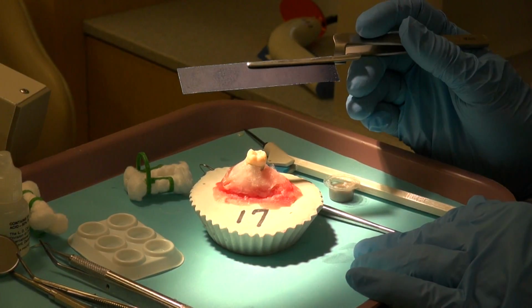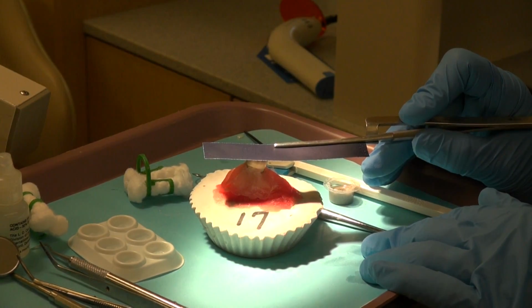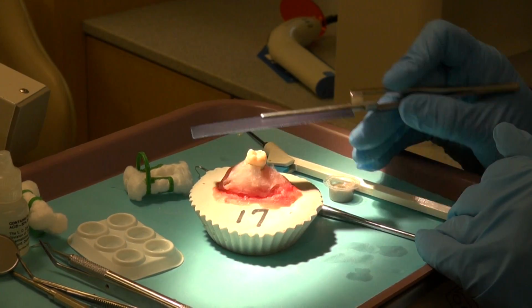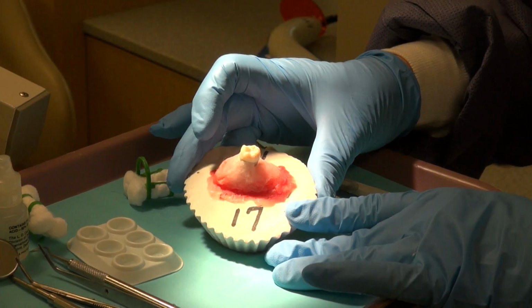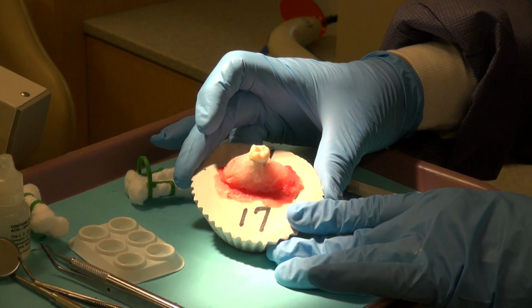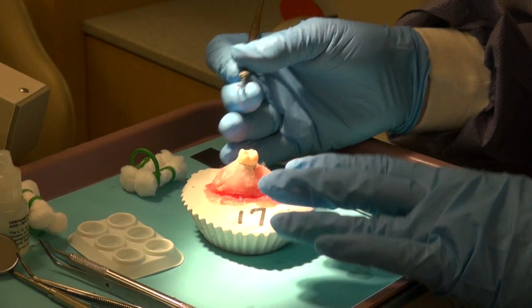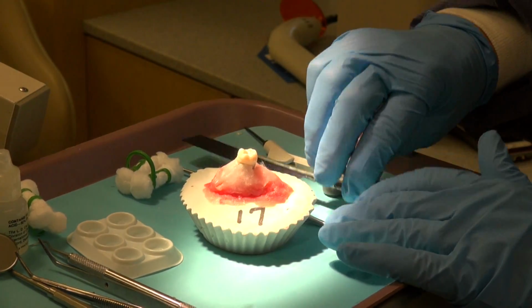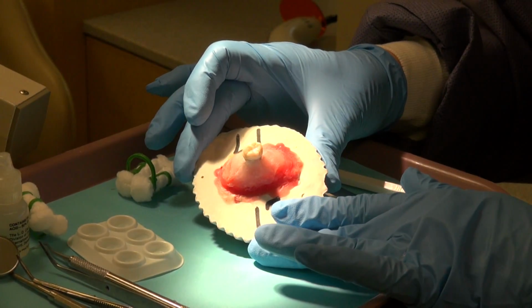Okay, you want to have your articulating holder set up and place your articulating paper on top of the tooth. Have the patient bite down, making sure that we don't have any high spots. And if we do, the doctor's going to have to come in and remove those high spots of sealant with a finishing burr, usually a number 4 or number 6 finishing burr. Take it right down. However, if you remembered after you place your sealant to take your Explorer and drag your material through, that usually doesn't happen. You'll end up having perfect occlusion and a wonderful long-lasting sealant.